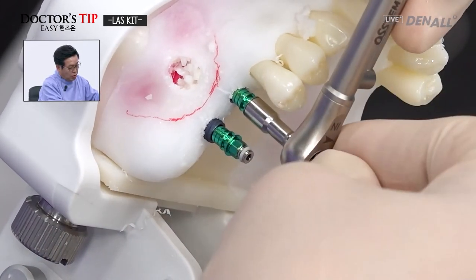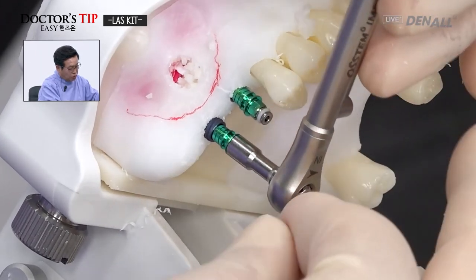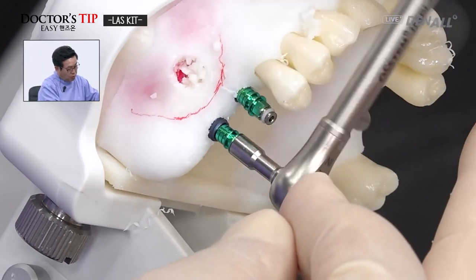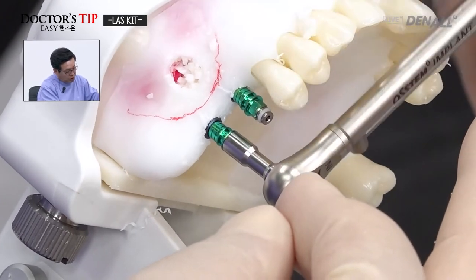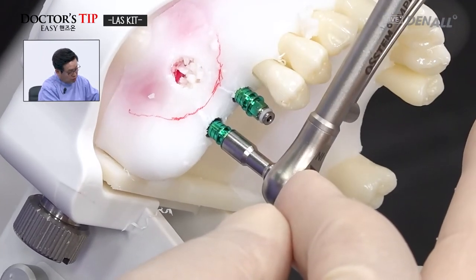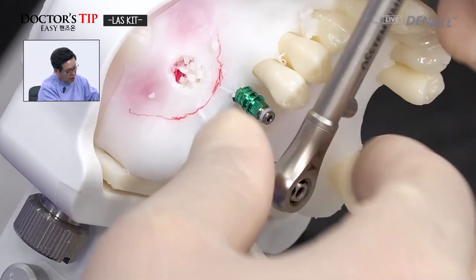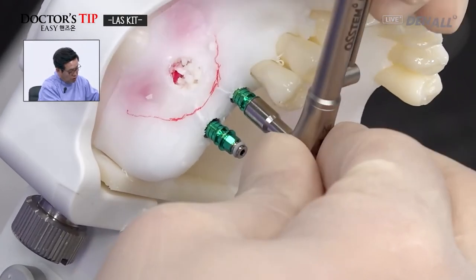In case of TS3, with residual bone height, you can go minus one millimeter, but if the residual bone height is not sufficient, you go to bone level because you cannot go too deep. But if you go slightly deeper than bone level, you'll be good. And you check that there is sufficient primary stability.